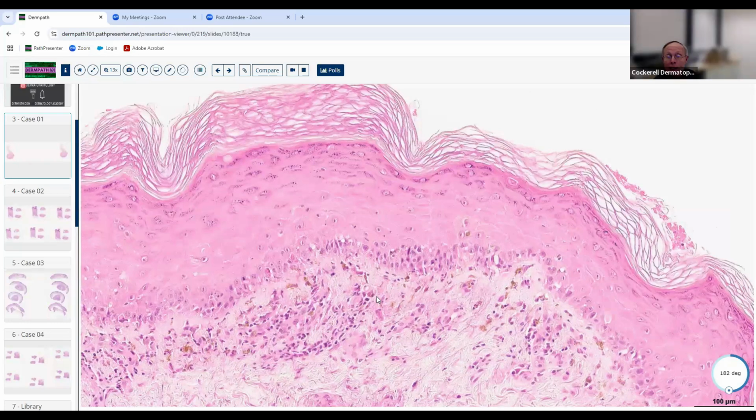And if we saw early EM that's in a stage of evolution and it's just got the dyskeratotic keratinocytes at the basal cell layer, usually you'll see a normal architecture of the epidermis because it hasn't had a chance to get the rete ridges to be effaced or anything. And you'll see the dyskeratotic keratinocytes often with some spongiosis, like you said, in early lesions of EM.